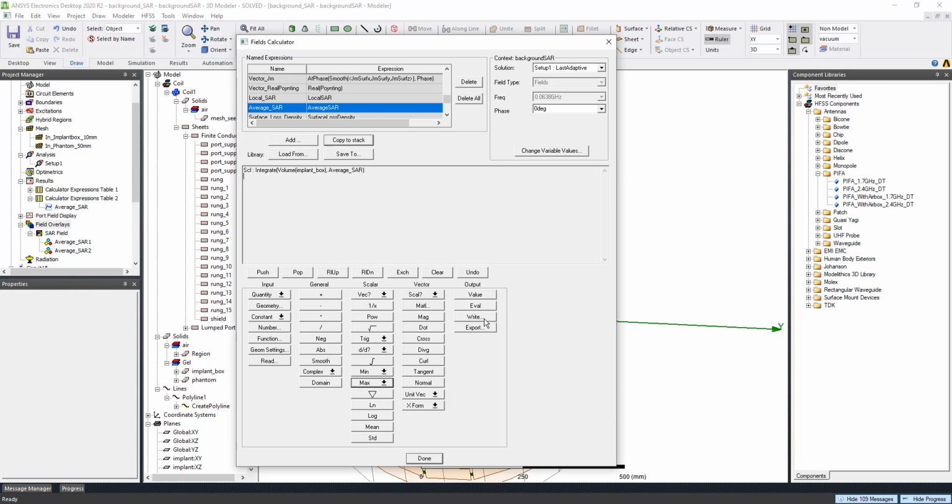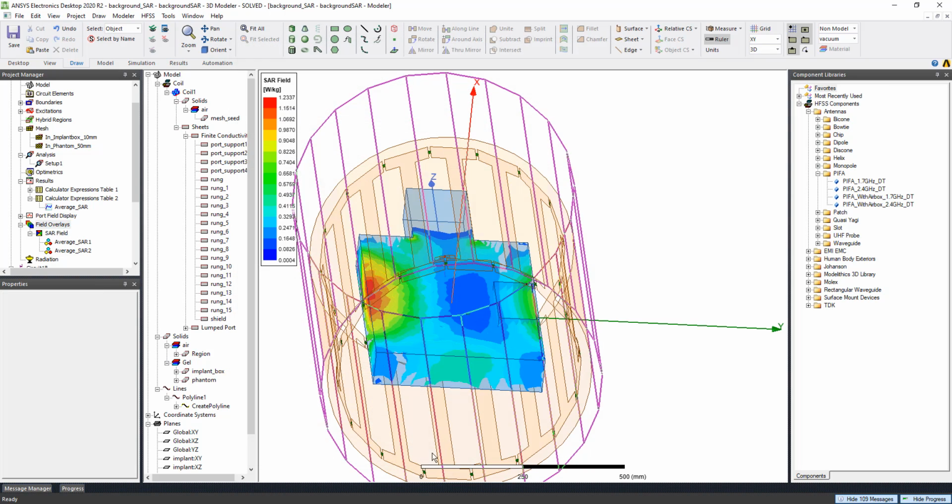Okay, so maybe not integrate. I need to undo that. I need to use domain and then use the maximum values. Let me see what I need to do here. Okay, so I don't need anything here. So when I choose the average and value, I just choose maximum values, and then when I eval, I can find the maximum SAR value in this case. And now we have the maximum SAR. Yeah, so this is very simple to do.